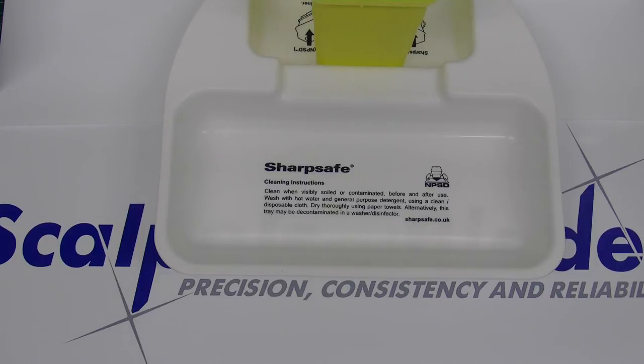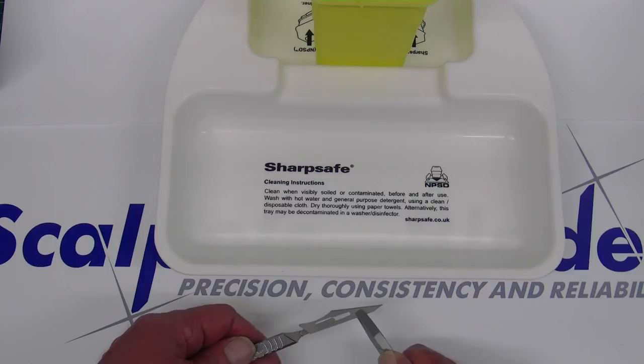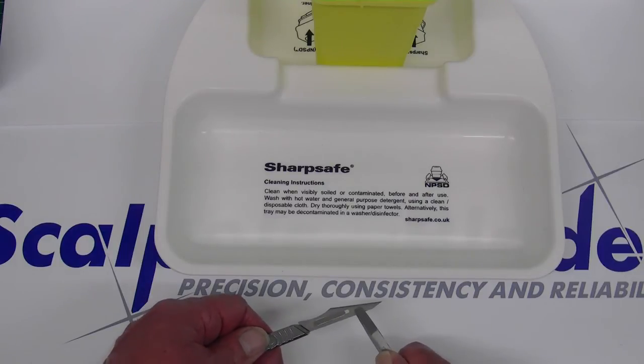For the blade fitting, hold the blade in either a pair of forceps or pliers, ensuring whichever tool you use grips the blade away from the cutting edge. Offering the blade to the handle, push along the slot of the handle and you'll hear it click into position.